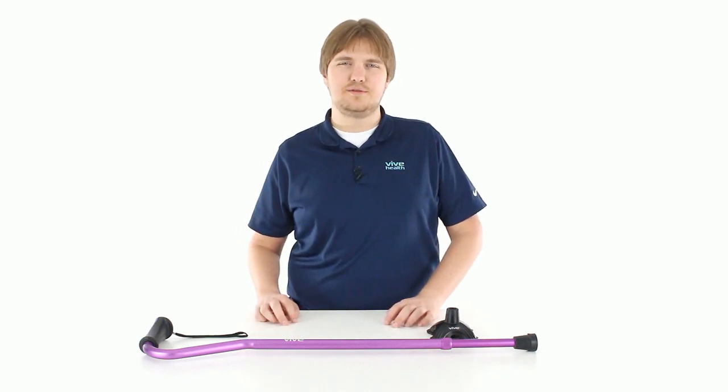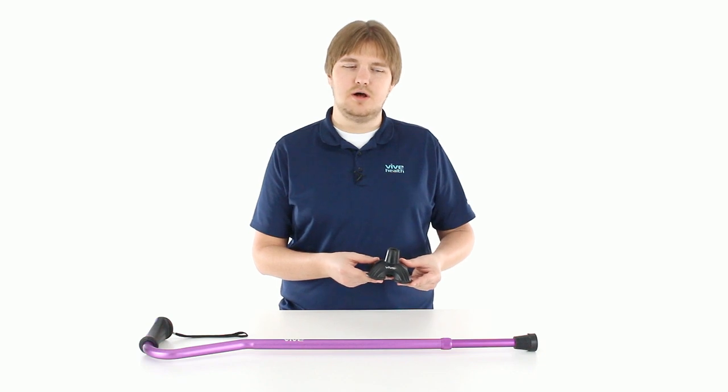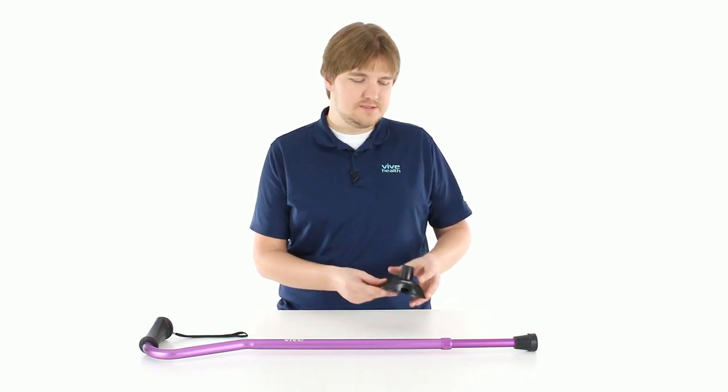Hi, this is Devin from Vive Health Customer Service with a quick tutorial video on how to install our Vive Quad Cane Base.